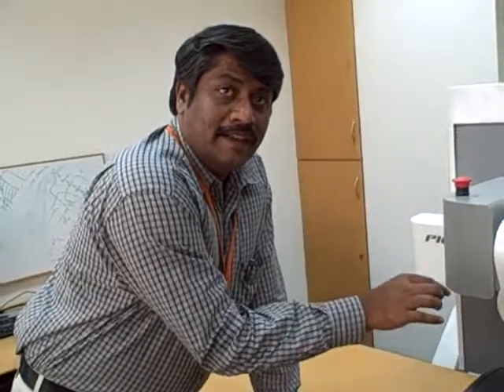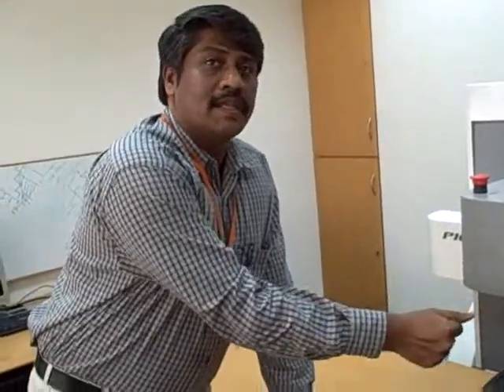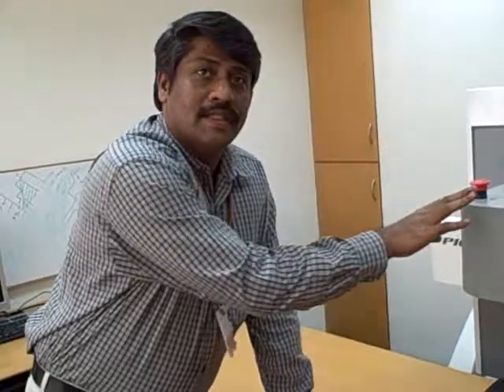So this is done by robotics then? Yeah, the movement of the equipment. The positioning, the trajectory enforcement is done through the robotics. The final insertion of the needle, we have consciously left to the doctor. Because you saw me push, at that time I could feel that the needle was going through the kind of tissue that I wanted. If the doctor had planned wrongly, and if there is a bone, the doctor would feel that he is pressing a bone. He would stop the procedure and press the emergency key and go and replan. Or if he was going through a cartilage or a blood vessel, the doctor gets the feel. That's called tactile feedback.